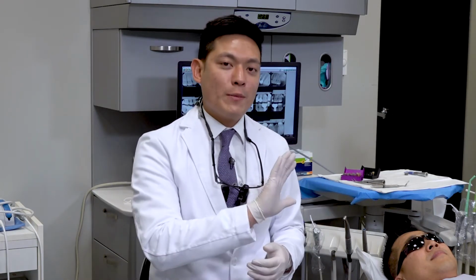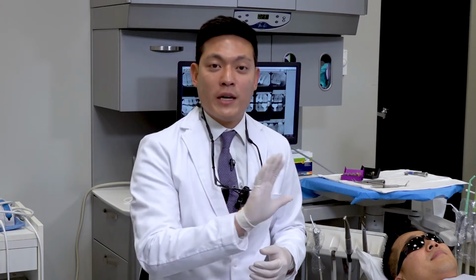So you've captured the preparation area, the prep quadrant, the opposing. Now it's how do we bring those together with an accurate bite registration? So whenever we take a digital bite registration, we capture the buccal surfaces of the patient's teeth when they're biting together. And then the system will use that position to digitally articulate those digital models.